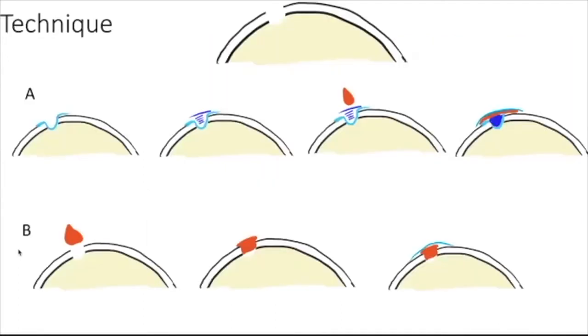So the technique that we now propose, I don't know if some other people use it already, but we find it quite useful. There are two ways. We tried both, and we share the results after we show a patient that has just been published in Eye Journal. The first technique is a multi-layer, where you put your corneal perforation, as you can see in the drawing on the top, and then you lay down a dry amniotic membrane of the shape that you like.